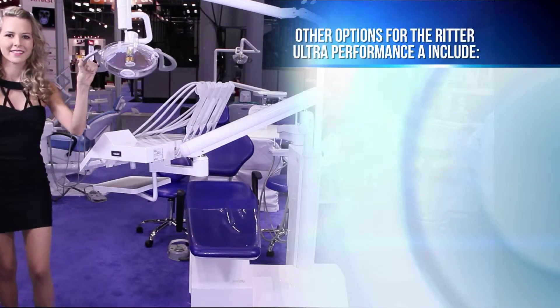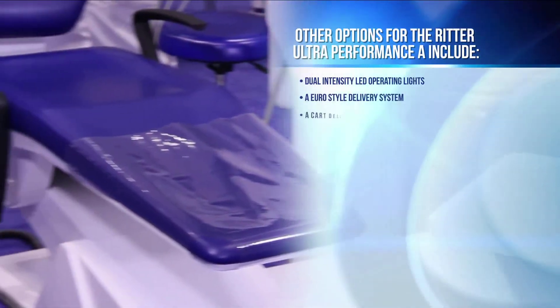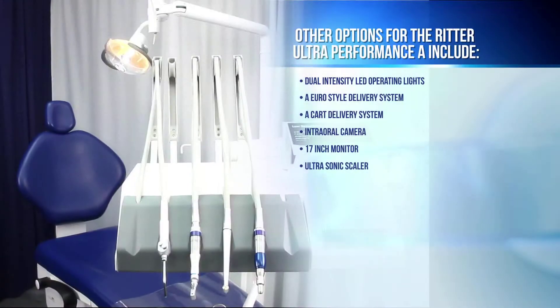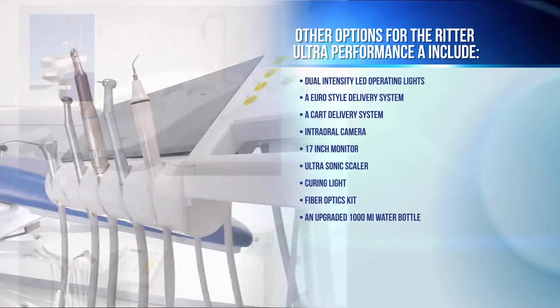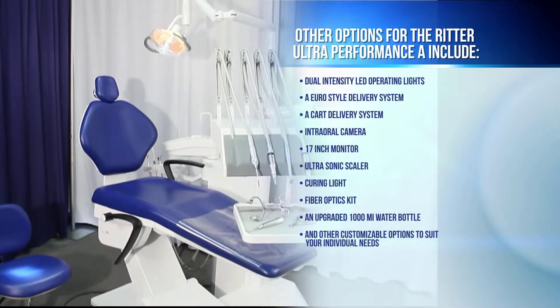Other options for the Ritter Ultra Performance A include dual-intensity LED operating lights, a Euro-style delivery system, a cart delivery system, intra-oral camera, 17-inch monitor, ultrasonic scaler, curing light, fiber optics kit, an upgraded 1,000-milliliter water bottle, and other customizable options to suit your individual needs.